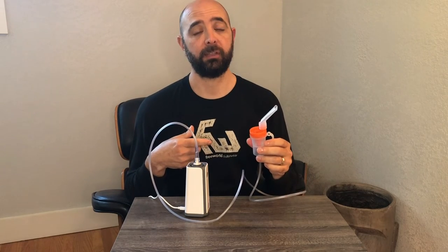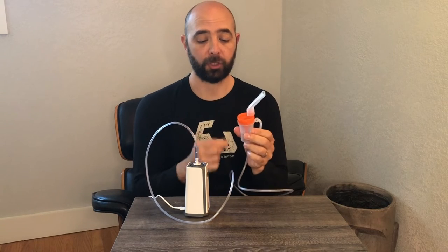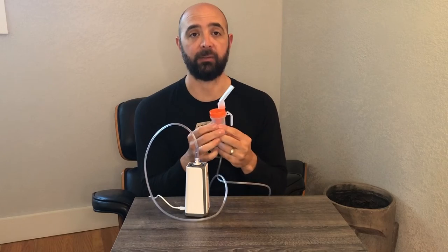Let's take this over to the sink area. I'm going to go ahead and fill this up with a little bit of water and then I'll show you how it works. You can actually see the air mixing with the water and how it comes out in these short little bursts, which is how you would take your medication.